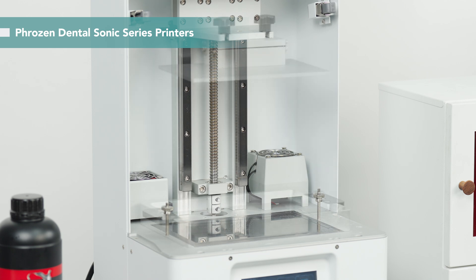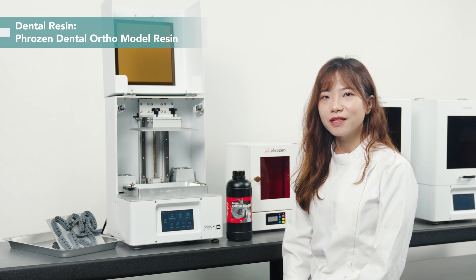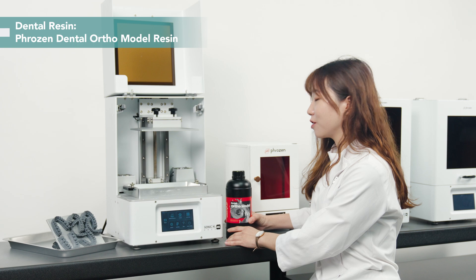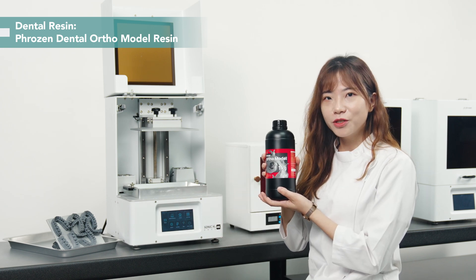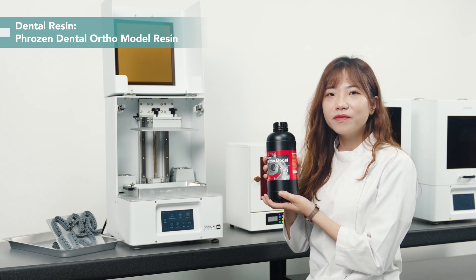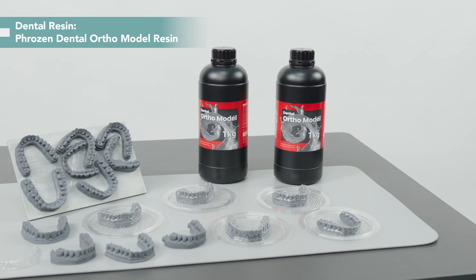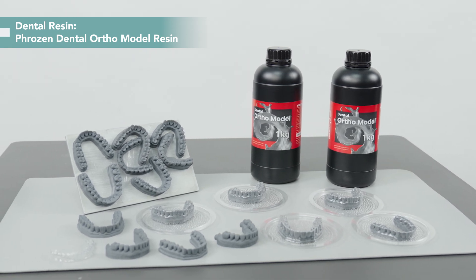Make sure the building plate and resin vat are securely sealed up. Today we use FrozenDental ortho model resin. This material is ideal for the job, with its impressive heat resistance up to 190 degrees and the ability to be printed at a 50-micron layer height — the perfect choice for printing highly detailed models for clear aligners and orthodontic appliances.